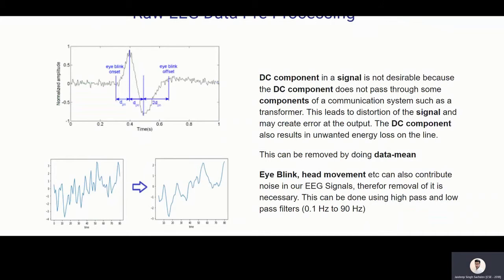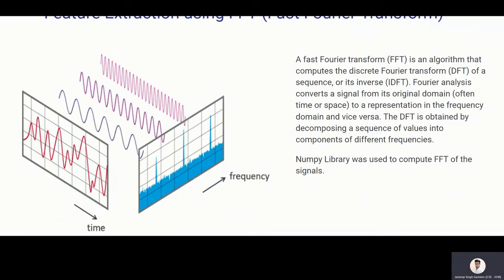Now, what is the data pre-processing method? The DC component in a signal is not desirable so I have removed the mean from it. Then there can be many noises like eye blinks, head movements and this can contribute a lot of noise in our EEG signals. So in order to remove it, I have bypassed it from high pass and low pass filter of 0.1 hertz to 90 hertz. I have also applied a moving average of 10.